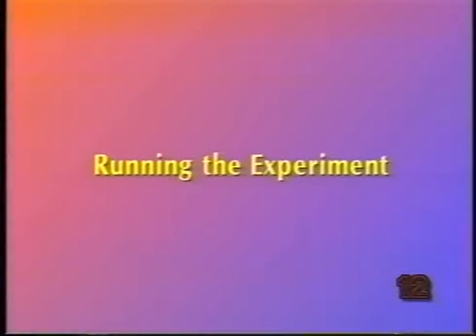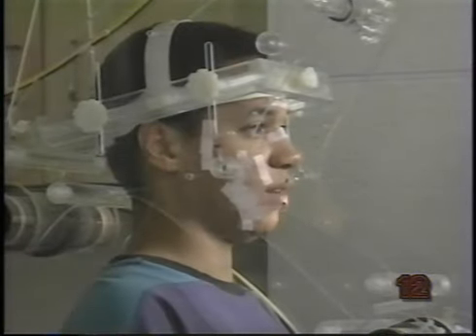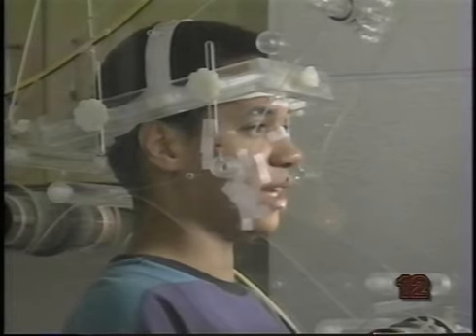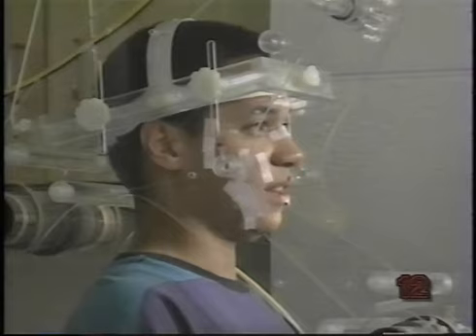We can record about an hour's worth of data. The recording time is usually limited by how long the intraoral transducers remain mounted securely. While the subject reads the text, an experimenter checks to be sure that the transducers remain in place and that the subject continues to be aligned in the transmitter assembly.